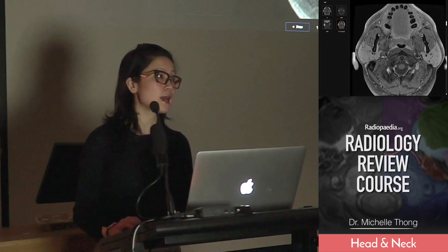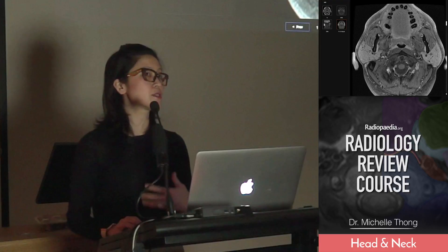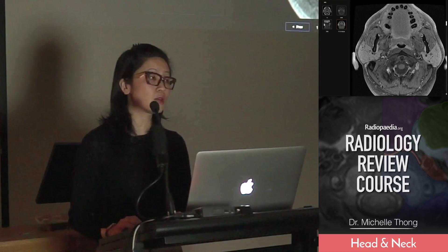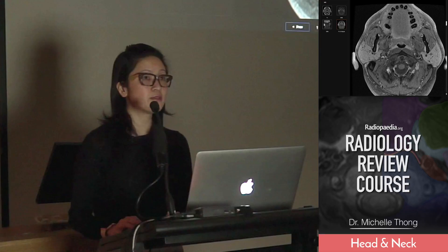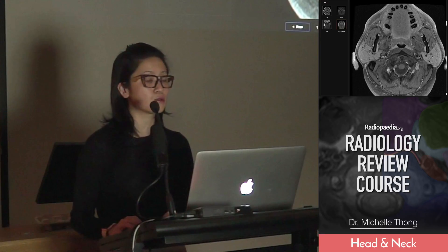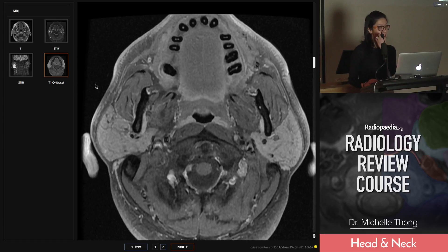Other diffuse diseases that can affect the parotid glands include Sjogren's and sarcoidosis. Don't forget — the parotid has lymph nodes as a normal structure, so lymphoma will affect the parotid glands just as much as it affects other nodes in the cervical chain. Other things include chronic duct disease, ductal calculi, and sialectasis. With chronic changes, you can get duct dilatation and little cystic areas forming in the parotid gland.